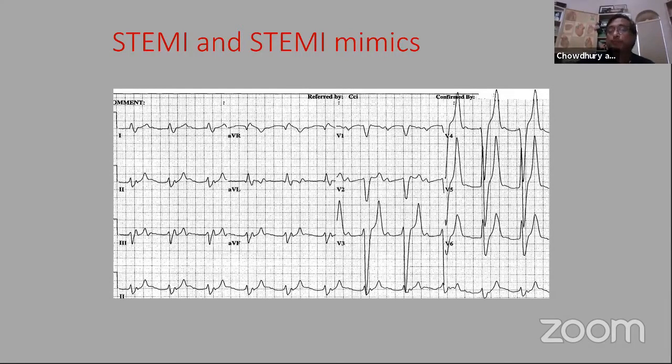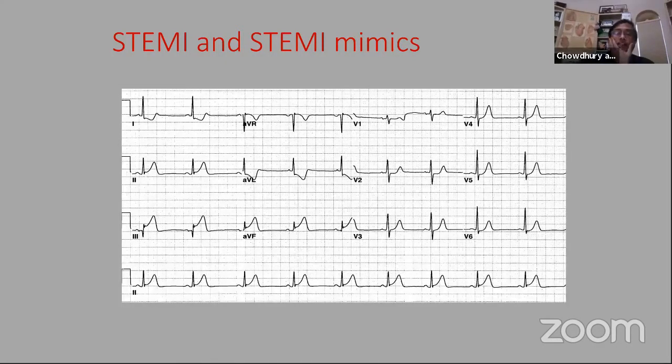By the time you prep the patient and do the coronary angiogram, the potassium will come back, but by this time you may be coding the patient. So this is very important. This patient came in with chest pain, but was not triaged in time. After 2 hours, the EKG was done, and by that time troponin came back 6, and this EKG.